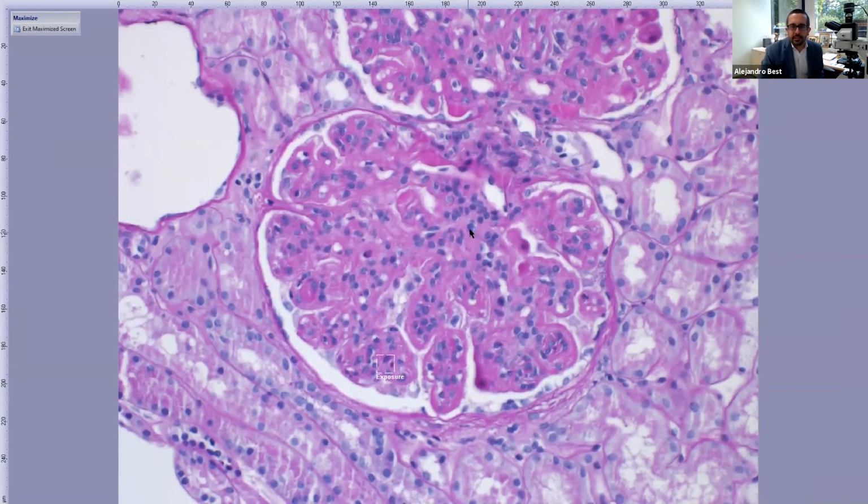Second, the mesangium, there's way too many nuclei. If you see 3 nuclei per mesangial region, that's already too many. And I mean, some of these are just packed with cells. So accentuation of lobular architecture, mesangial expansion with mesangial hypercellularity.